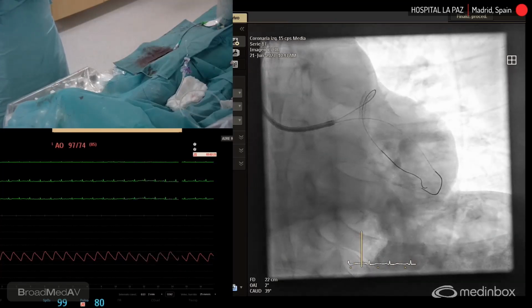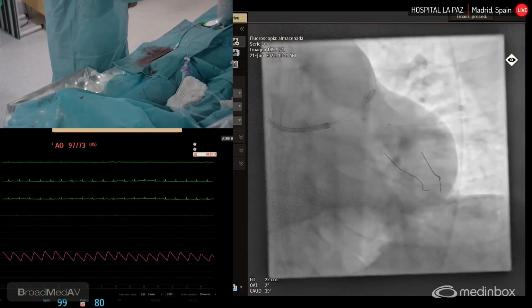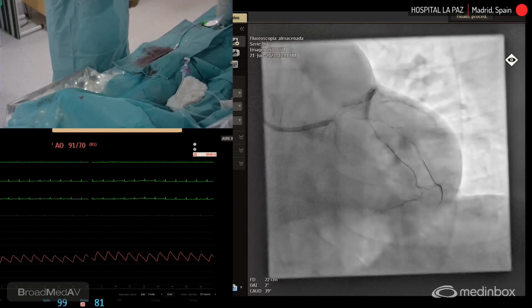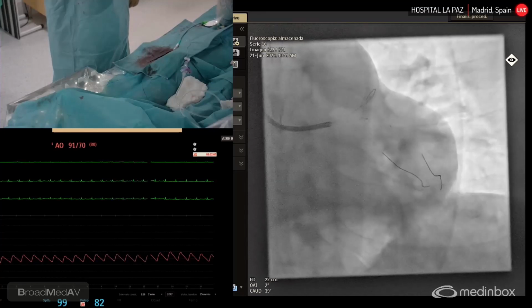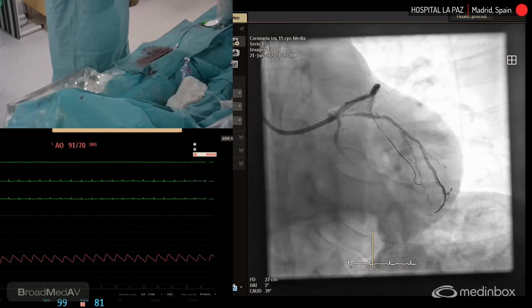Sí, ¿el siguiente cuál es? No digo de longitud. No, de más que 16. We are searching. 20. El balón era 12.